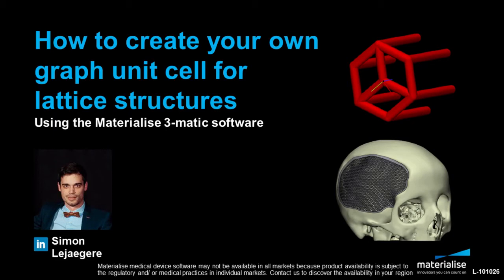The most common way to start creating a lattice structure is from a unit cell. This will be repeated many times in the volume or onto the surface you selected. Because a graph unit cell can have many complex shapes, it is nice to be able to create your own and adjust it on the fly.